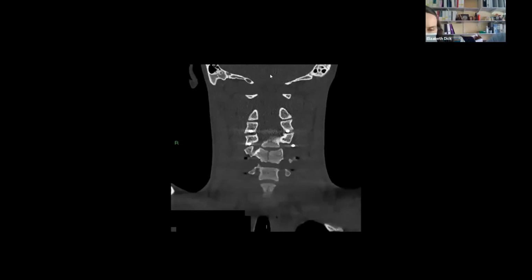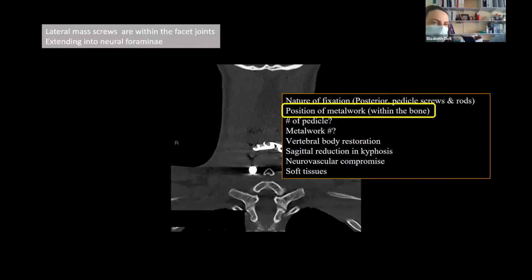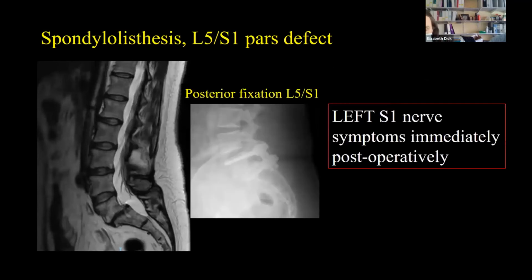Okay, good. So that is that patient. I'm going to put these in as well. So what we said is that the lateral mass screws are within the facet joint, also extending into the neural foraminae. Okay, so next patient I want to show you, we'll speed up a little bit because I'm conscious of time. This patient actually did have an elective operation, but we're showing you this because they have a complication that you can see acutely. As soon as they had their L5 S1 fixation and they woke up, they had left S1 nerve root symptoms immediately.